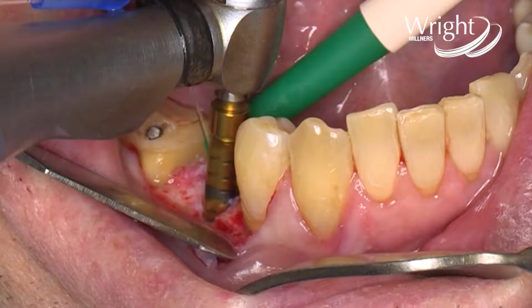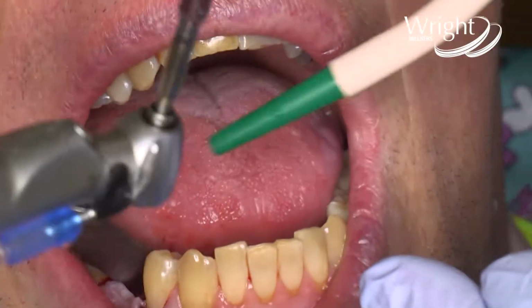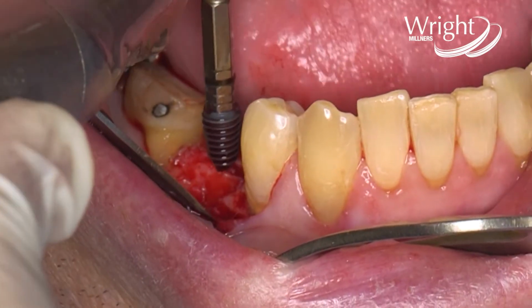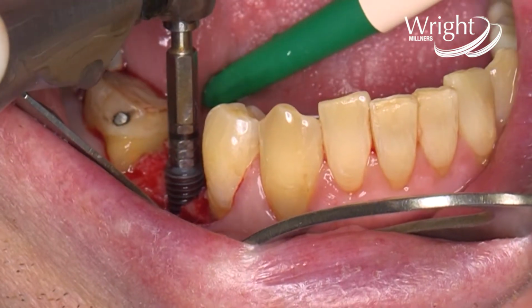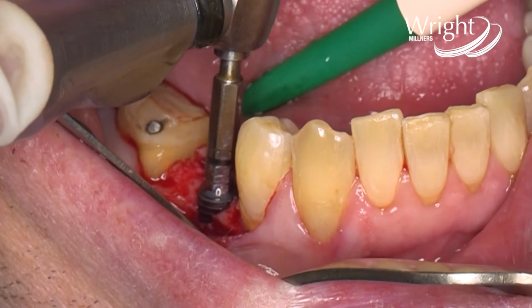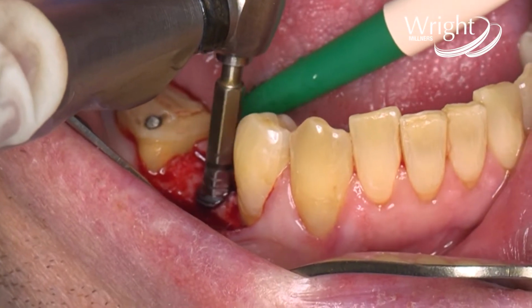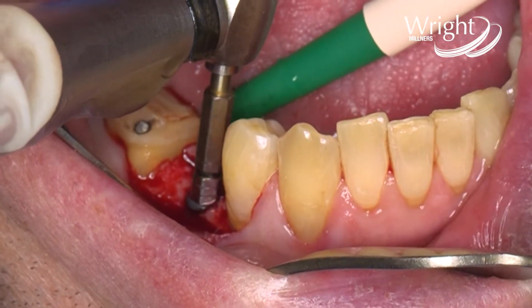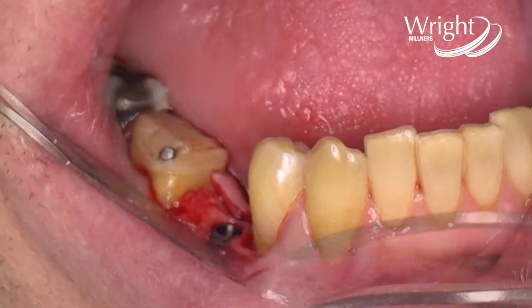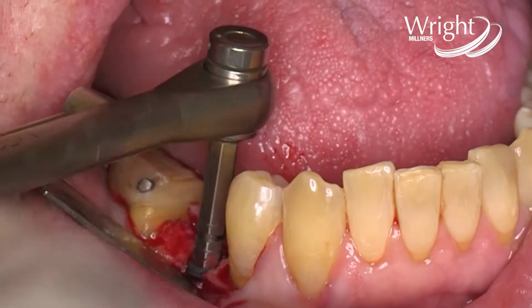So we've got our 3.8 drill again. I'm going to take my profile drill again, making sure to choose the right one. And now we will try and seat our implant again. There's the implant. And now we can see that implant sinking below the crest of the bone. And it bottoms out, as you can hear at the torque, but you can already see it's subcrestal. Turn it in a little bit more.